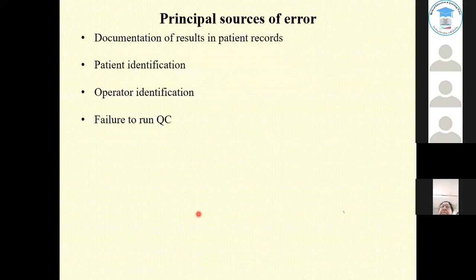So that is where your judgment comes in. You have to speak to your instrument provider, look up the inserts to get your equipments regularly calibrated, then see how you can run the quality control. If it's advised once a month, then maybe get the equipments to your laboratory and then run the QCs once a month, or maybe just train your users to be able to run the QCs.